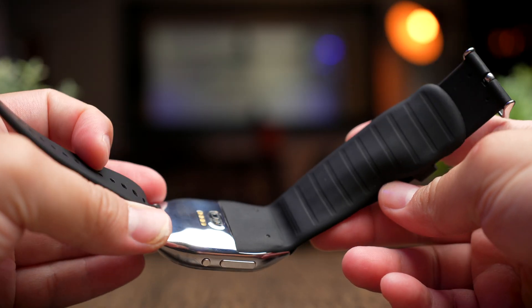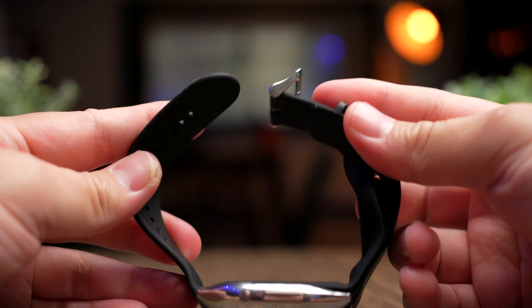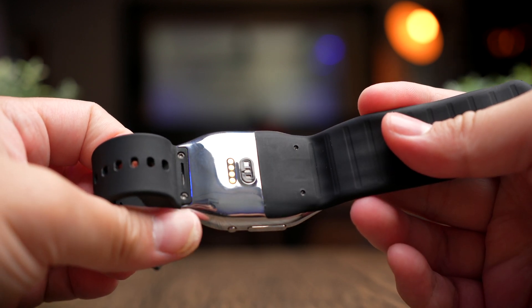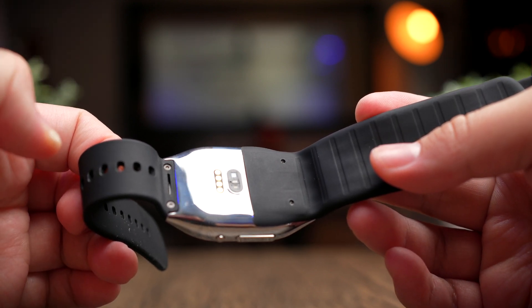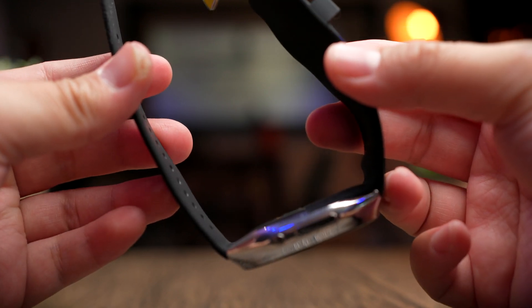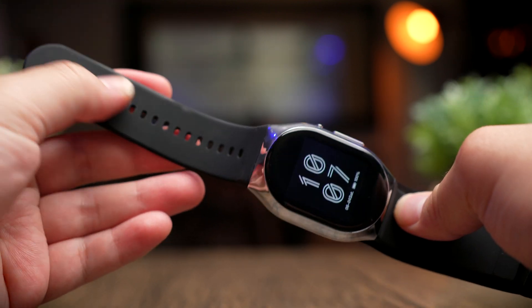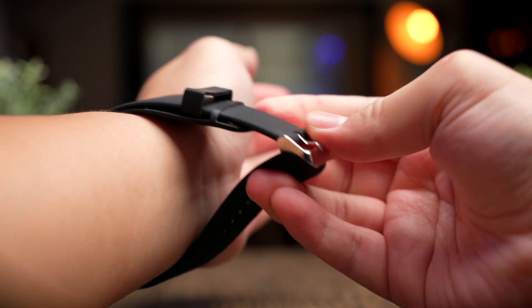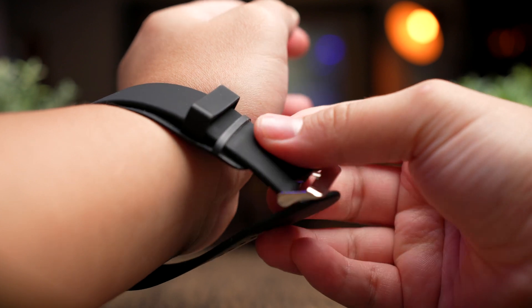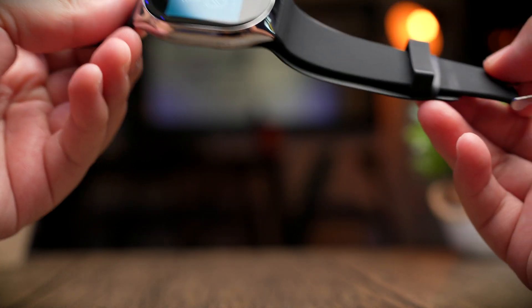The watch band is actually mounted upside down out of the box, likely because of the inflatable cuff. You can screw out and flip the bands, but I hope YHE addresses this because the upside-down band is very difficult to put on due to muscle memory. If you wear the watch normally, the holes are on top and the buckle is at the bottom — it's not intuitive at all.